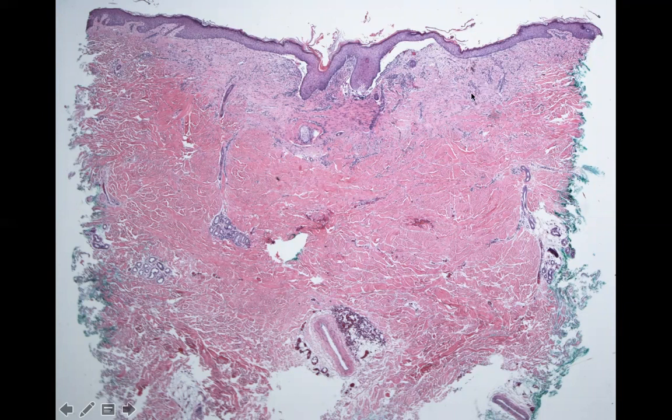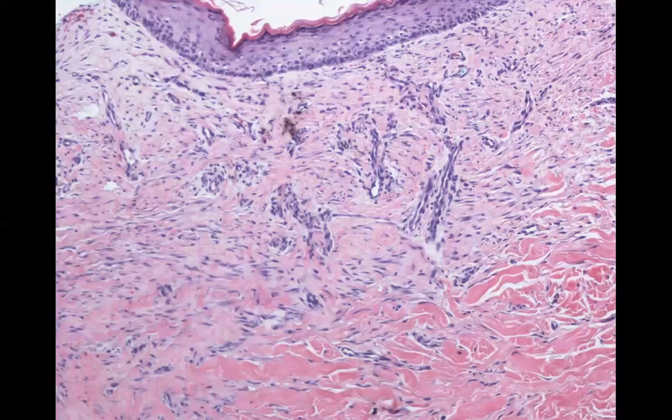Now you're a little bit less blue, and you're more mature. Your inflammation is going down, and you've got this horizontal collagen. You see it squishes your vessels and makes them orient vertically. And then eventually it'll all be red. See, here's your vertical vessels. Your collagen is kind of oriented horizontally because it's firm, right?